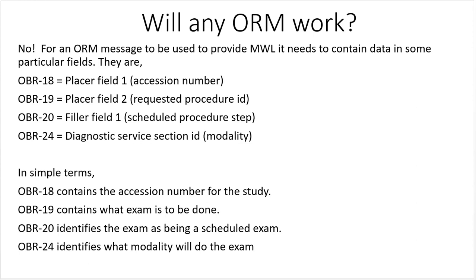Will any ORM work? No. For an ORM message to be used to provide modality worklist, it needs to contain data in some particular fields, and they are OBR18 placer field 1, the accession number, OBR19 placer field 2, requested procedure ID, OBR20 filler field 1, the scheduled procedure step, and OBR24 diagnostic service section ID, the modality. In simple terms, OBR18 contains the accession number, OBR19 contains what exam is to be done, OBR20 identifies it as a scheduled exam, and 24 identifies what modality will do the exam.